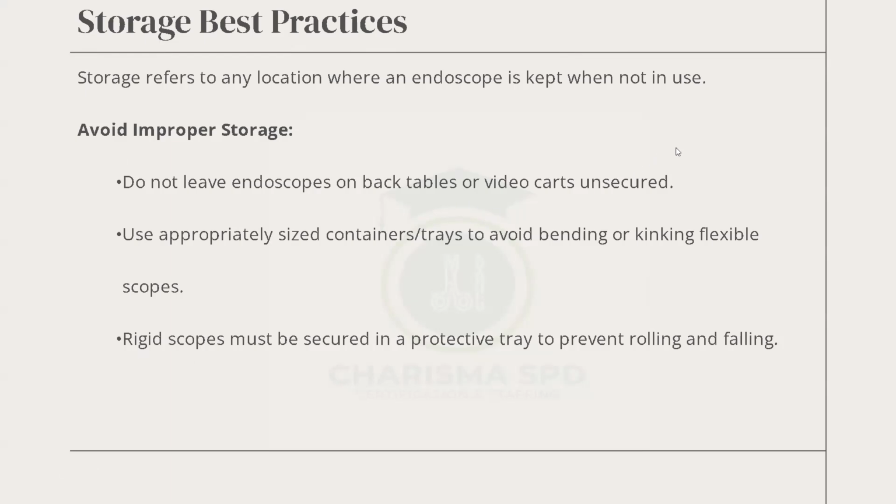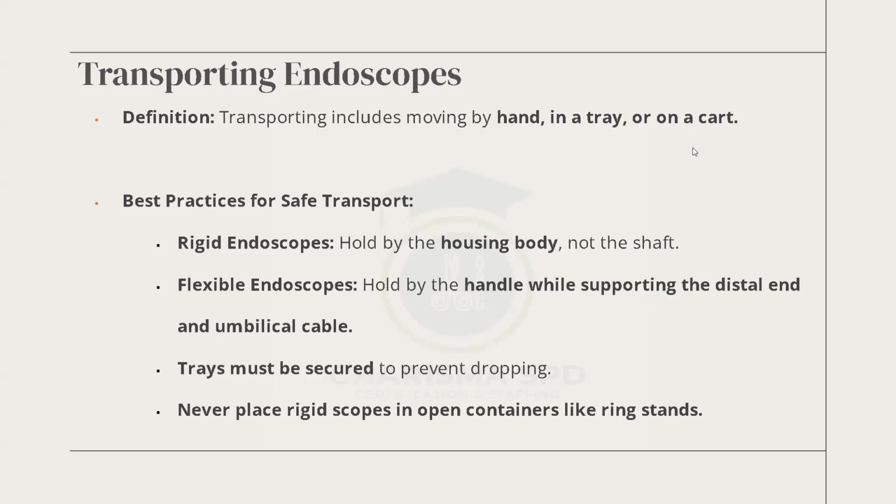It's loud and clear. I don't need to talk much. It says that for transportation, do not put heavy instruments on scopes. We have said that. Put the scope in the container that it came in. Don't switch it. If you're in the OR, they always switch it. Sometimes they don't care. They just want to get out. So let them do that.